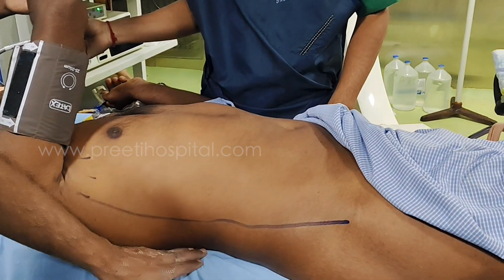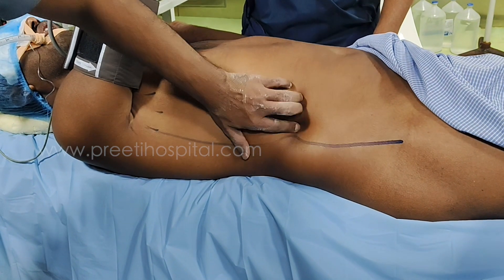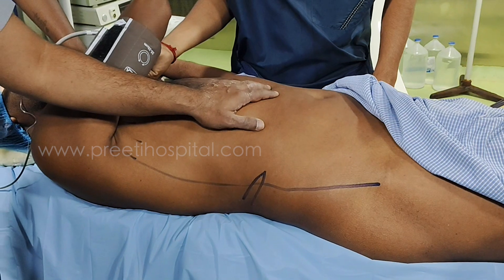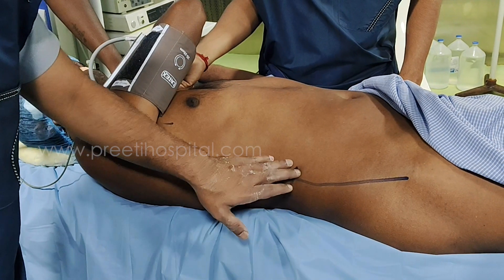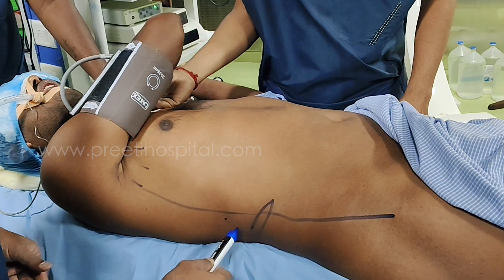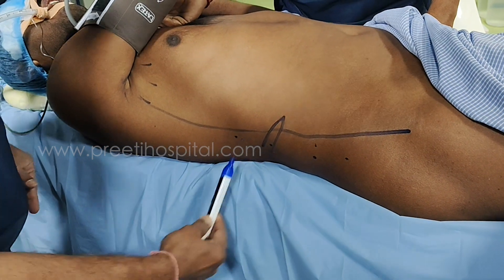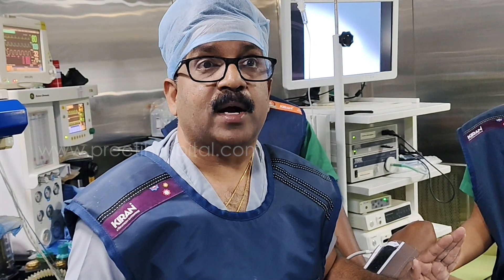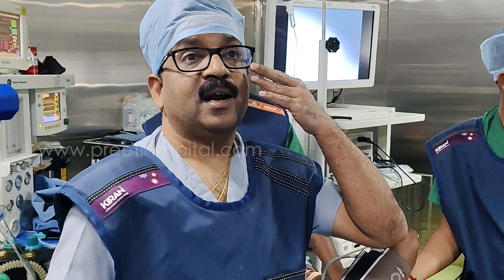The rib tip is very important — the costal angle is up to here, and that is where you puncture in prone. But in supine you might wonder how you can puncture. In supine PCNL, posterior axillary line is not the only important landmark — rib tip is very important. In supine you puncture horizontally, so you will always access only the lateral part of the calyx. You cannot puncture the medial part, which is good — because medially the renal artery vessels will be there.